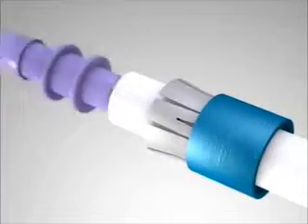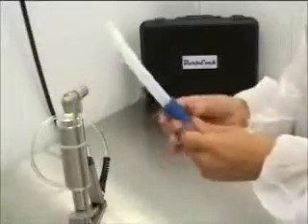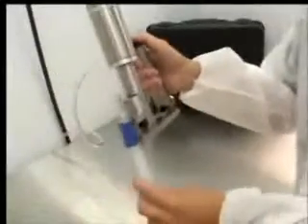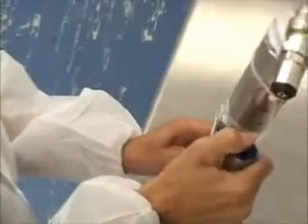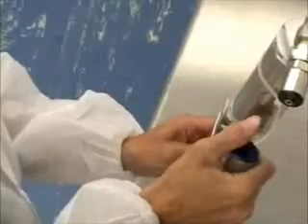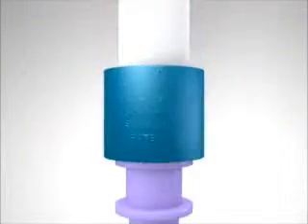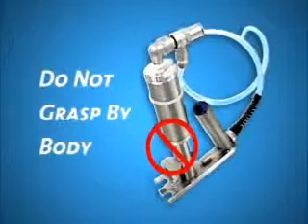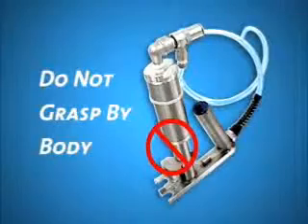Insert the barbed fitting into the top of the tube and slide the pre-locked sleeve and collet over the barb until the collet base is flush with the top of the tube. Place the sleeve and collet into the saddle of the PAD. Grasp the handle of the PAD and press the air button on top with your thumb. Release the button. The assembly is locked when the bottom of the sleeve and the collet have snapped into place and are even. Please note that, for your own safety, do not grasp the PAD by its body.